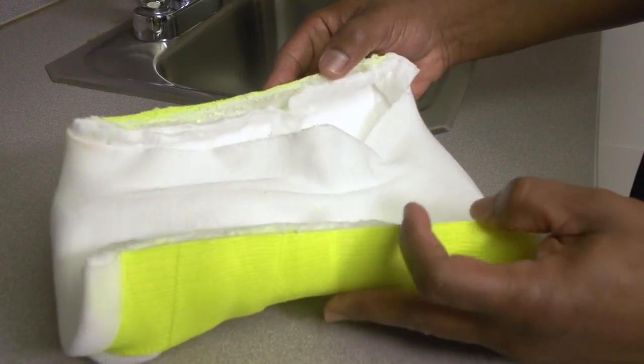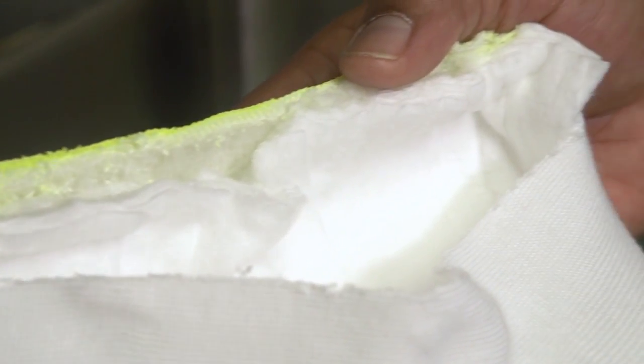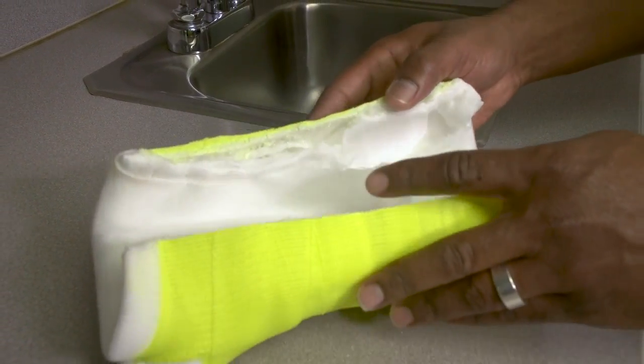It's important to keep your splint or cast clean and dry. If the cotton padding and dressing underneath the fiberglass or plaster becomes wet, it could irritate your skin or any wounds you may have underneath the cast and could even cause an infection.